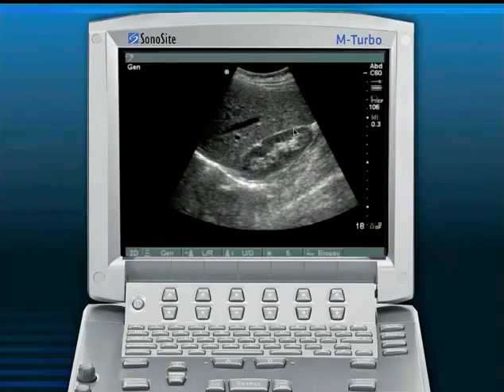This is the reflection of the kidney and the liver. Here's the diaphragm over here. And this says gen, or general mode. And so if this transducer goes from 1 to 5 megahertz, the general mode is right in between, say, 3 megahertz.